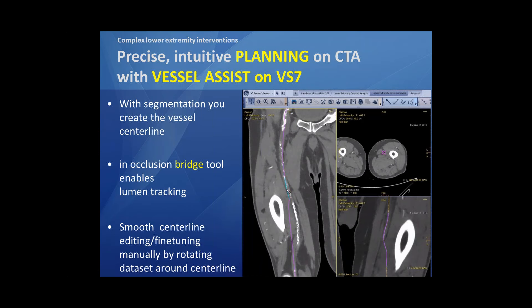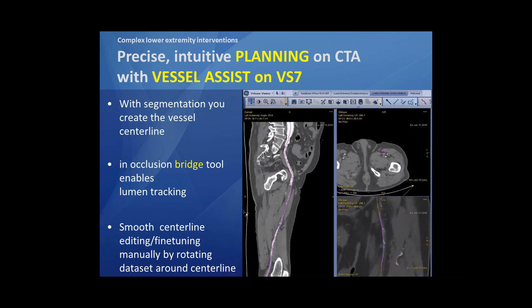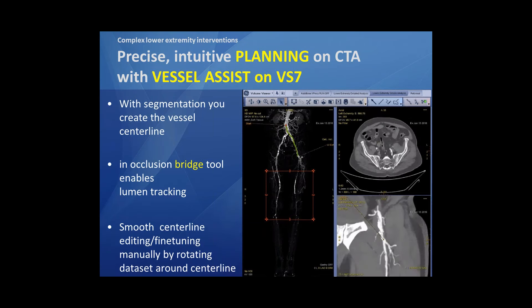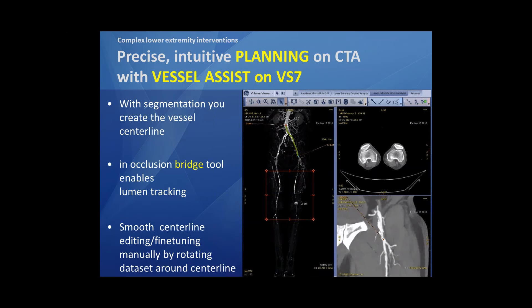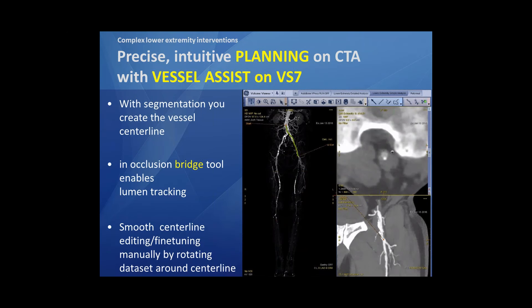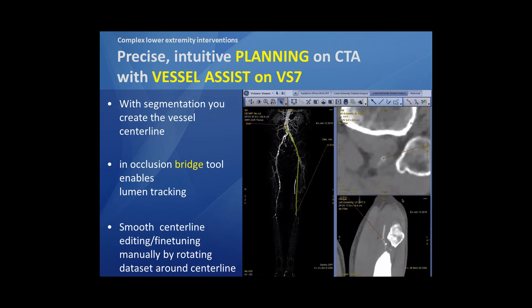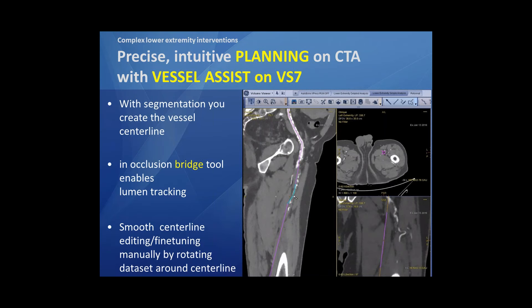Afterwards, as you can see, manually by rotating the data sets around this initial center line, we can really adapt, edit, and fine-tune the lumen tracking all over the occluded track of the SFA. Based on calcifications and older landmarks, we can really fine-tune the central line tracking and prepare it for the day of our procedure.